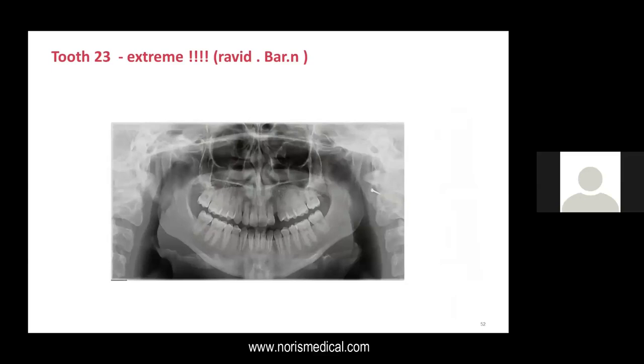This is a very interesting case. I like it very much. This case is actually, from my point of view, after a not so successful orthodontic treatment. Actually, the patient came to me and she had this space between tooth number 22 and 24. Actually, I'm not sure that the orthodontic treatment really accomplished its original need.